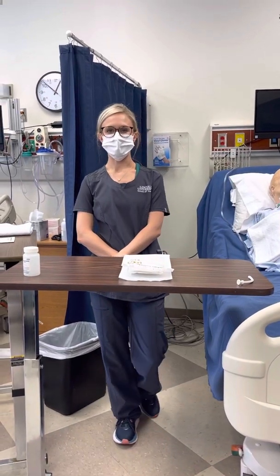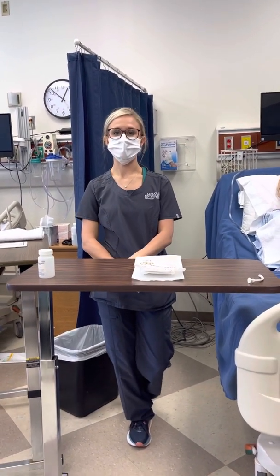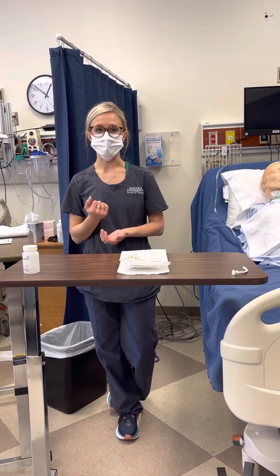Hello, my name is Madison Knipp. I'm an 8th semester nursing student, and today I'm going to be performing suctioning on my patient's trach.